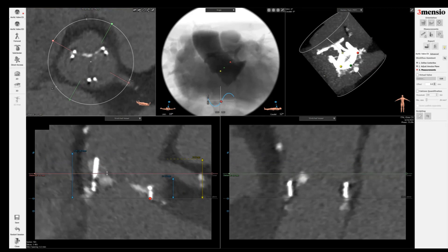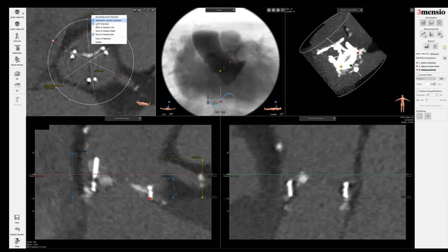In terms of the sinus of Valsalva, I'm going to divide this by two. Sometimes it's very hard to see, especially in a patient with a tube graft replacing an aortic root — you will not be able to see the sinus of Valsalva very well because there's no aortic root present. I'm going to label these in terms of the right and left.